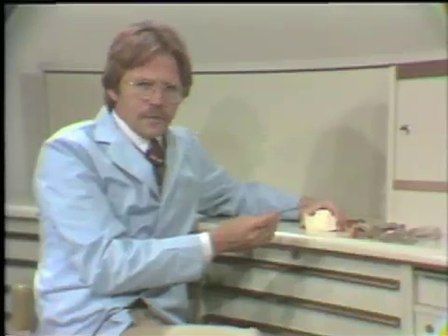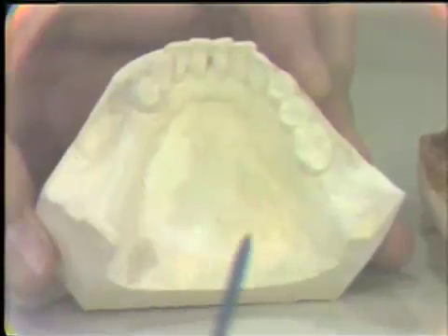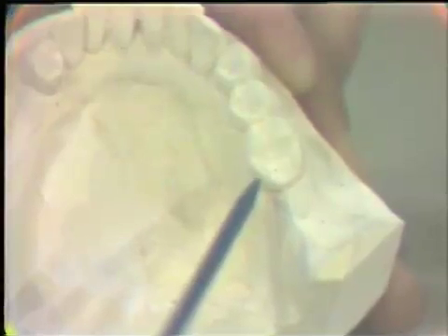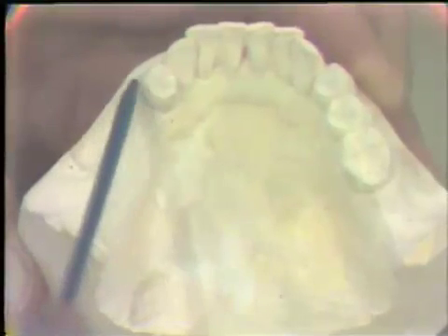This custom tray would be necessary for patients who have very high attachments and where the fit and design of the appliance is very critical in that area. The impression material should be bubble-free. We want to look at this cast and identify areas of particular importance, because we are going to use the diagnostic cast to treatment plan and design the partial denture. We want to get alginate material very accurately and bubble-free around the abutment teeth, as they will have the direct retainers and clasp units. Both the remote abutment and the abutment on the opposite side are potential abutments, and we must get an accurate registration of those teeth.